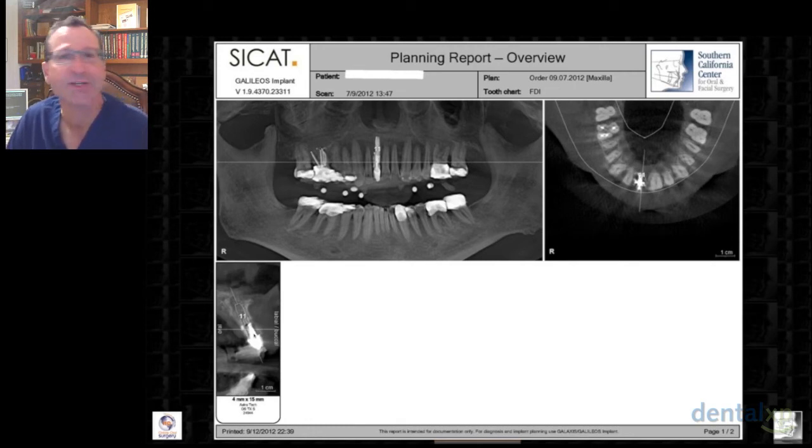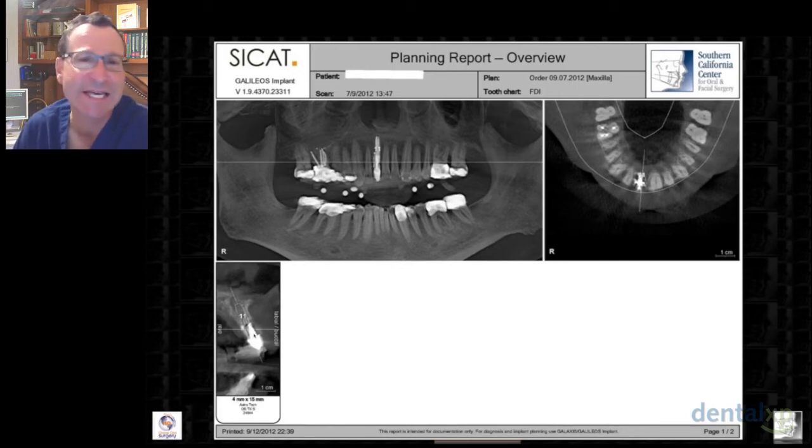And I always tell my patients that when we're doing an immediate prosthesis, the tooth is a party tooth. It's there only for looks. It's not there for function. And if there's any doubt in their mind that they can stay on a softer diet and stay away from that tooth for at least 6 weeks, they get a flipper or an Essex bridge. Also, we always make an Essex bridge as a backup to have at surgery, just in case I place the implant and it feels not quite as solid as I would like it to be. We've always got that backup ready to go, and so the patient doesn't have to leave missing their front tooth.